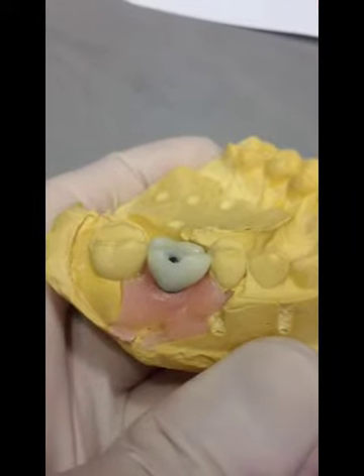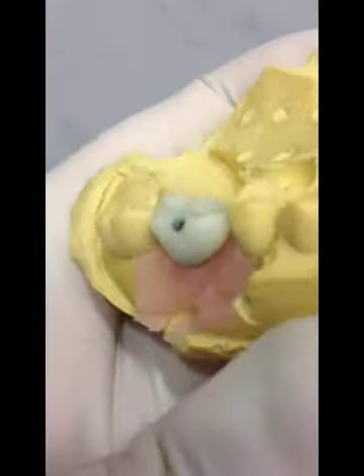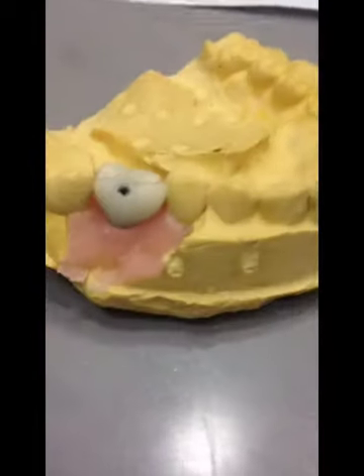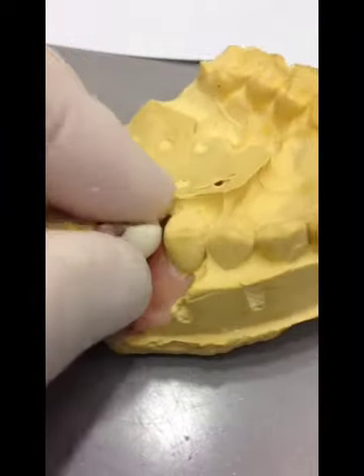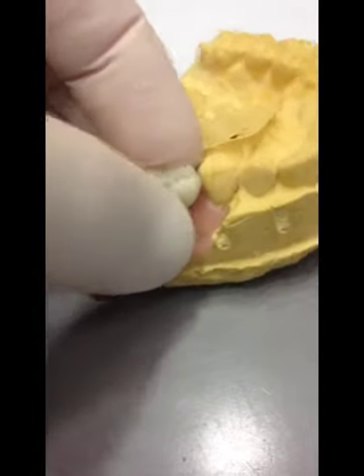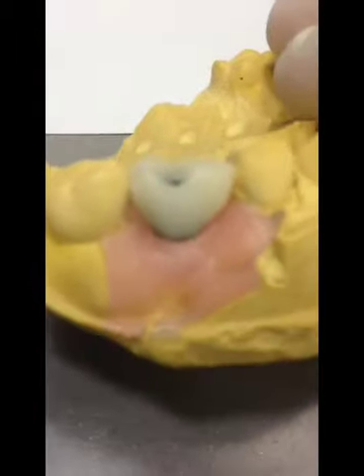Alright. And here's the final restoration. Obviously before we screwed it down and before we put it in the mouth, it's here on the cast. We've got it cemented completely with the Reliax Luting Plus, and we know that we have a good path of insertion. The crown comes right off here, and then we can just stick it right back on here. It's hard to do this with one hand. Go with the right hand. There we go. And that's just how it'll be in the mouth.